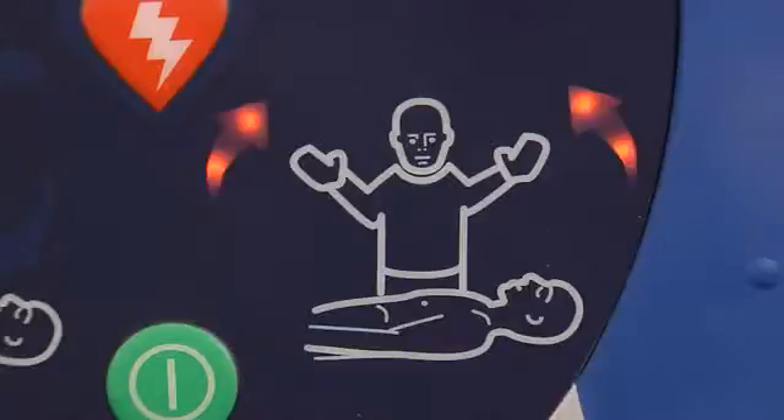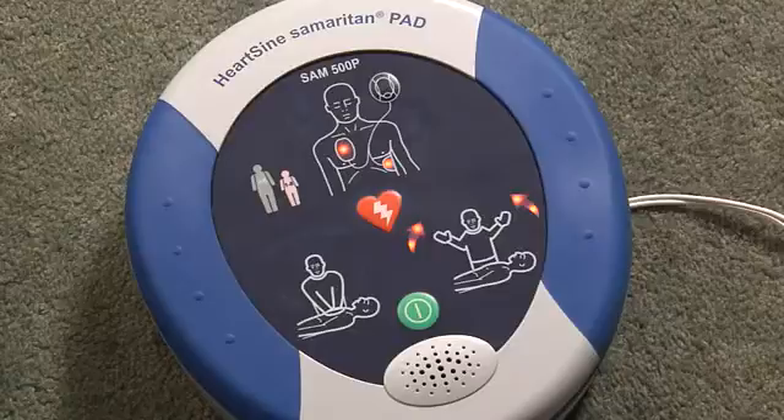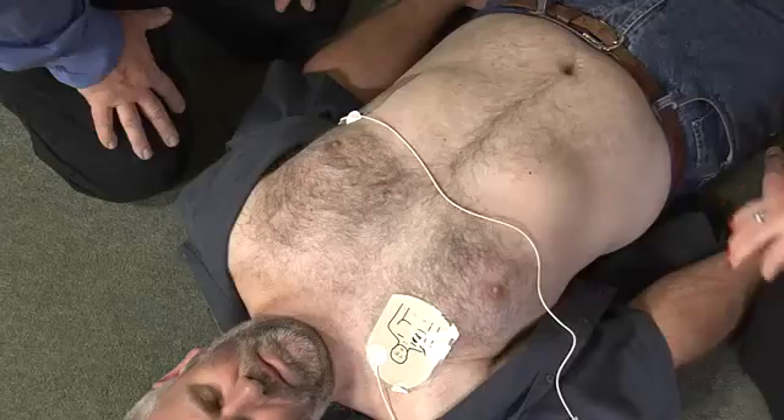Assessing heart rhythm — do not touch the patient. Analyzing. No shock advised.